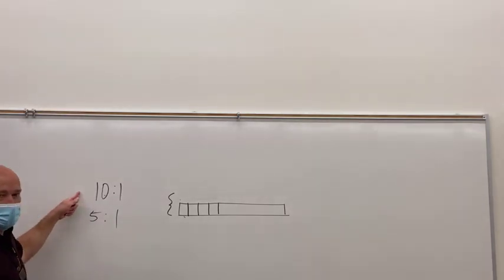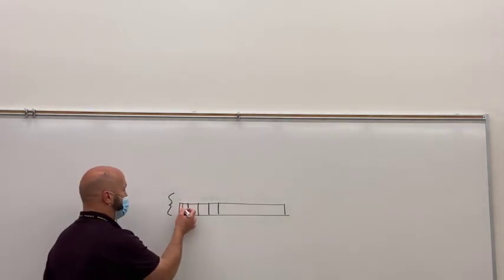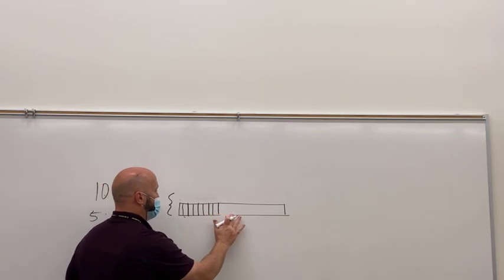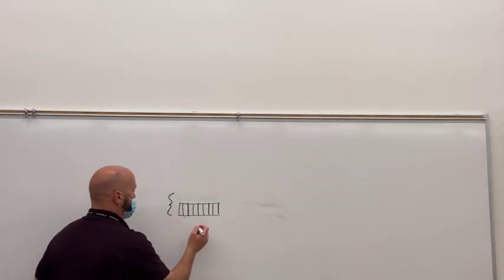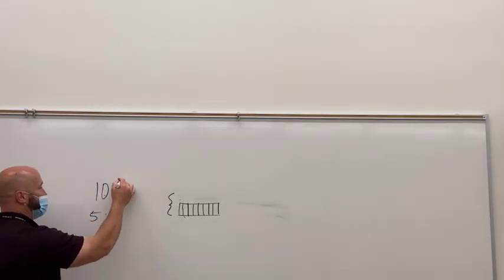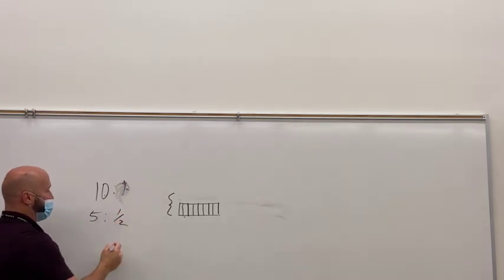But we decided that 10 to 1 was kind of the ideal, right? So what if we came back through and re-entered grid strips in between? Now what happened to the interspace material? We cut the height in half, but we also cut the spacing in half, so it's now 5 to 1/2.